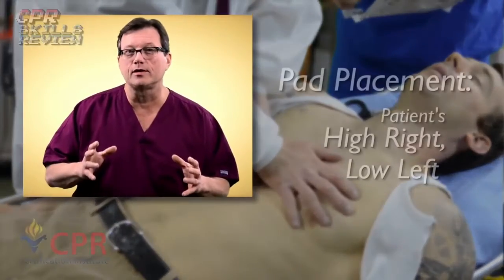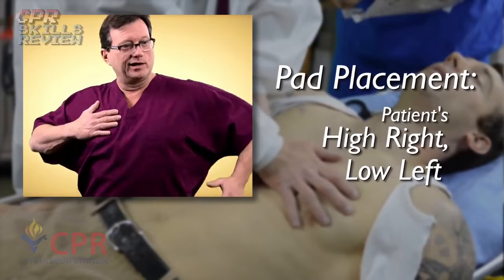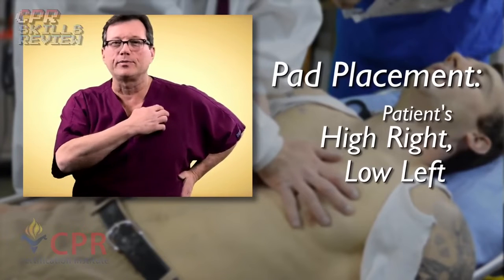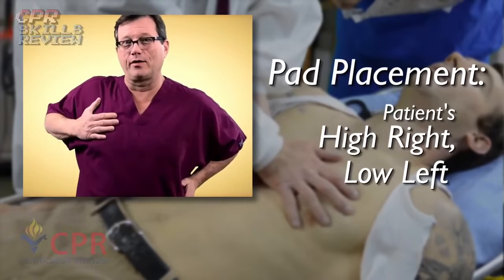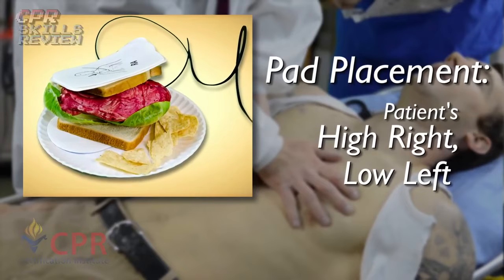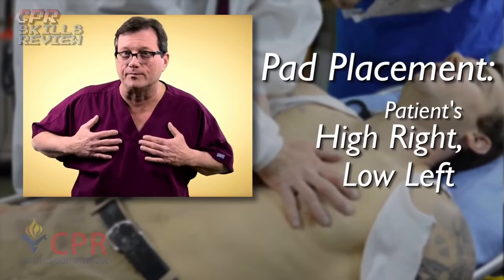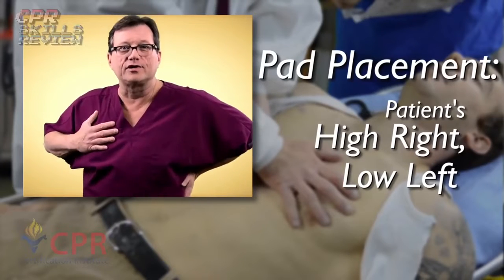Now remember, when applying the defibrillator pads on the adult chest, you're going to place them high right, low left. High right, low left — for a couple of reasons. One, most implanted devices like an implanted defibrillator or pacemaker are placed under the patient's left clavicle. For that reason, we place the pads high right, low left, with the intent of making a heart sandwich. We need the heart in between the pads — energy goes from one pad to the other. So again, the pads go high right, low left: heart sandwich.